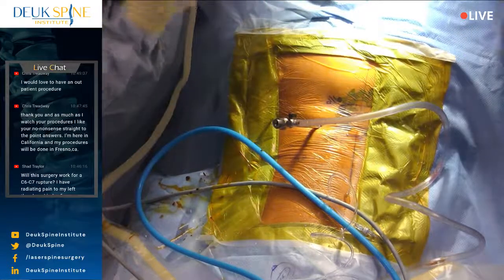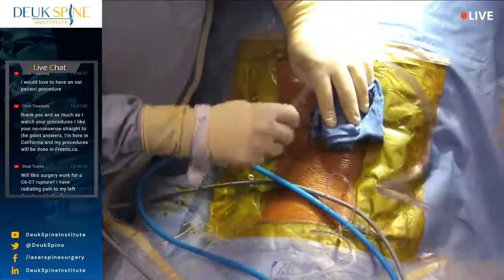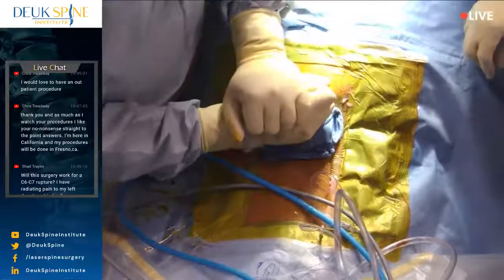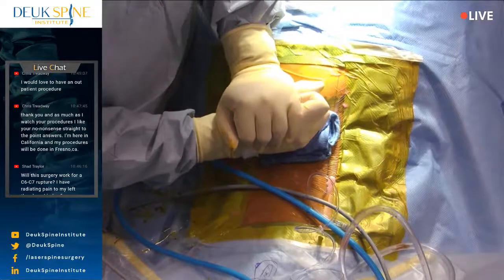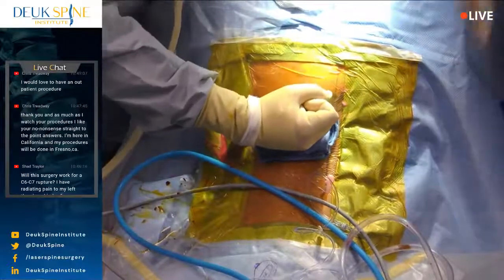All right, let me show you all what we've got here. Can you see the incision? Yes, you can. I'll put a little bit of pressure. I'm going to call our EBL 3 mL. So we lost 3 mL of blood, which is nothing. Each milliliter is 20 drops, so you're talking about 60 drops of blood. It's not much. Nothing to get excited about.